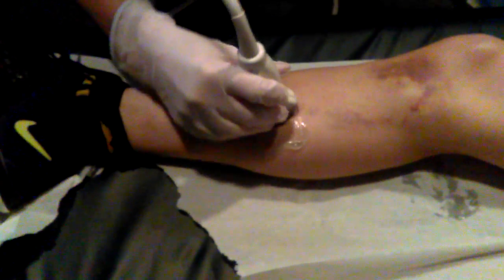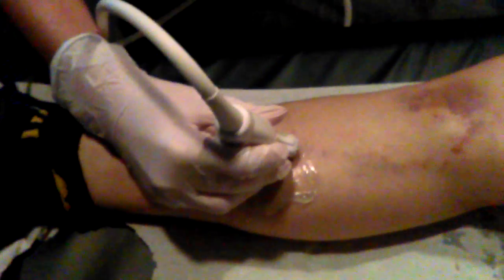And then posterior tibial, you're going to be getting those at the calf and at the ankle. So turn this back out. For the posterior tibials, we get those at like the medial calf. So just put your probe down. You usually get them kind of in this little crook right here. You'll feel like if you bring it up, it kind of stops at the shin bone right there. And then you can just angle your probe back and forth until you see them come in.